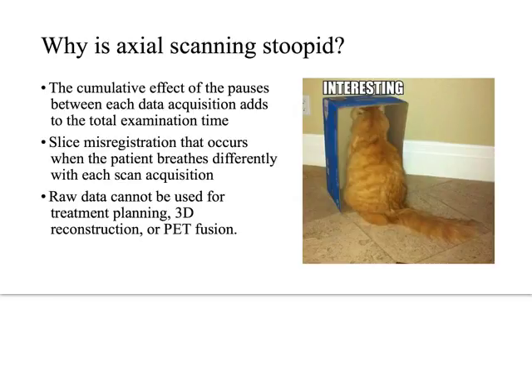Okay, so why is it stupid? Number one, the cumulative effect of all of this scan, move, scan, move, scan, move, adds to the total examination time. Where I could just scan and move, right? Like, can you imagine if I walked like that? If I was like, walk, talk, that's what you're telling the machine to do. When it can walk and talk at the same time.